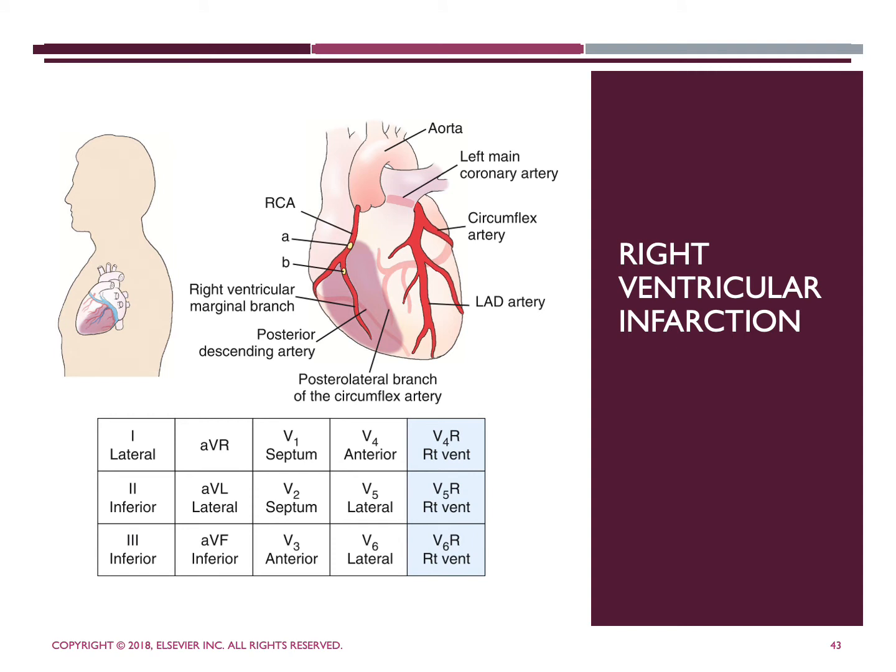So what we're looking at here, we're going to start by looking at the heart real quick. What we're really looking at is a right ventricular infarction, what we call RVI. The first thing I want you to look at is the letter A at the heart with the arrow pointing to it, and then we're also going to be talking about the letter B.